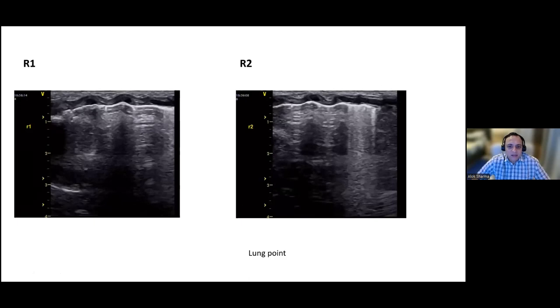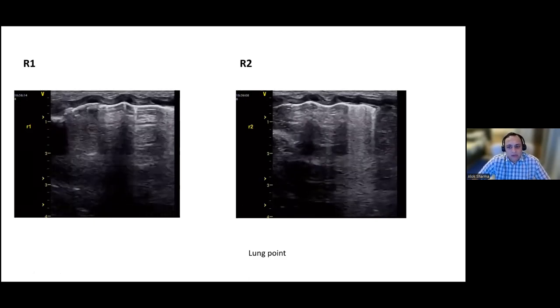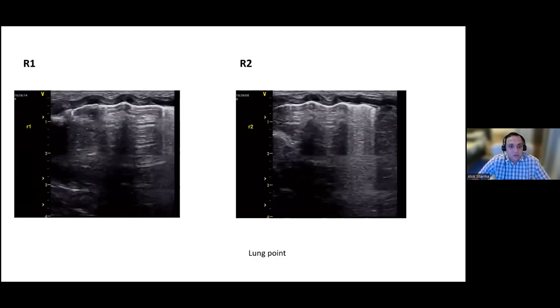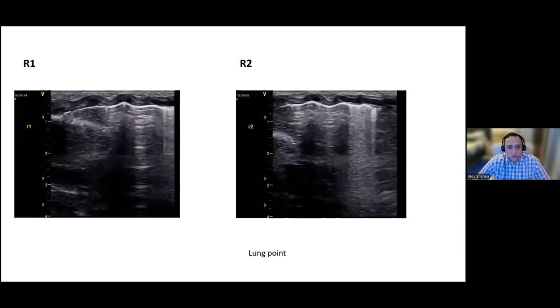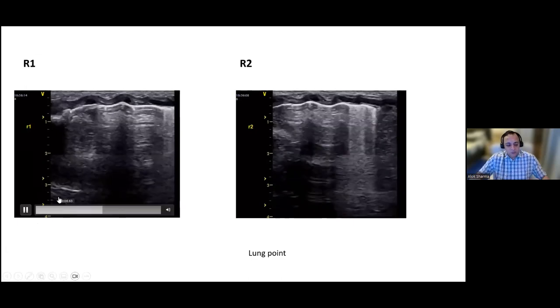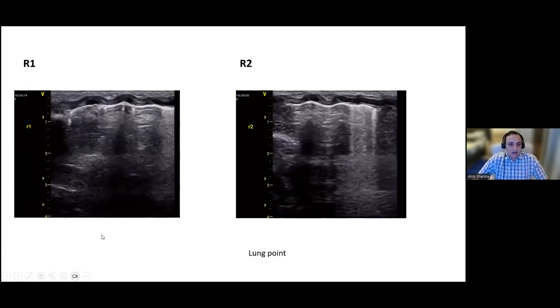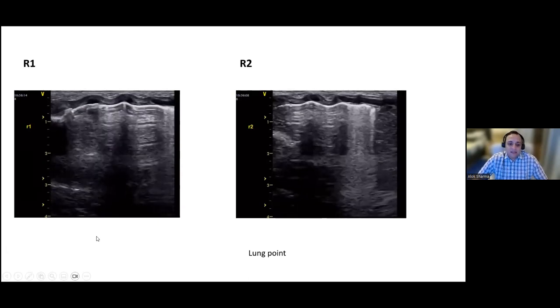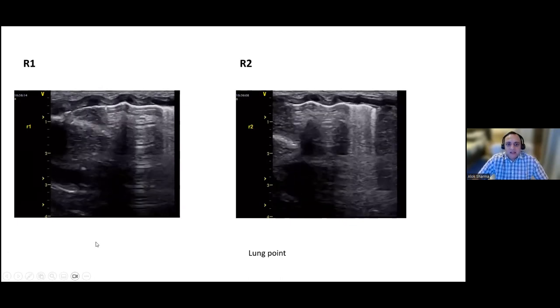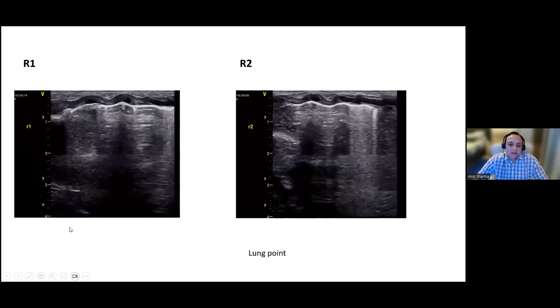And it's just an awareness that spared areas are also described in transient tachypnea of the newborn. But more importantly, when you have respiratory distress syndrome, if you give surfactant, you can see spared areas as well. And it's not unusual in the improvement phase of respiratory distress. Mild RDS presents with a B profile and subpleural consolidations. But actually, as it gets better, again, you'll have areas of aeration. So you can see a double lung point, even in RDS. And you can see spared areas in RDS. But classically, the authors have described both these things in relation to trying to describe TTN.